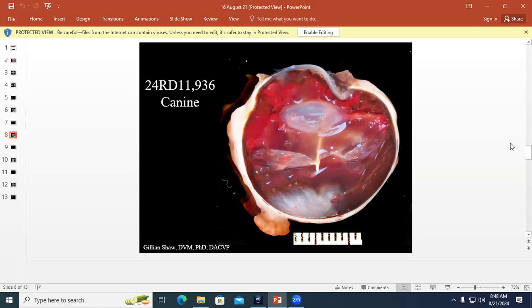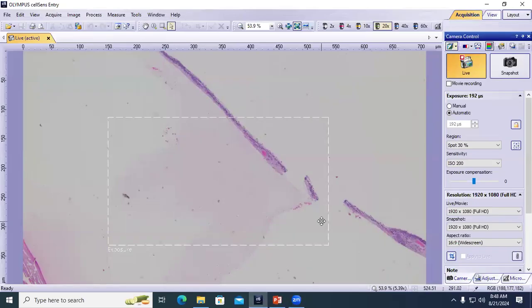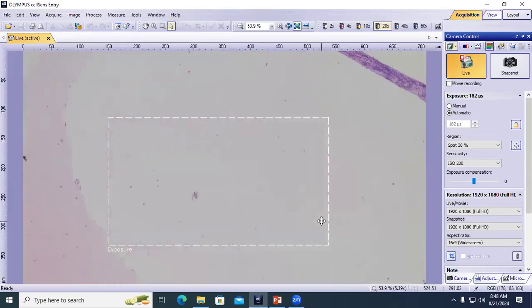The cactus quills are organized in a real specific way. They tend to be a little rounder, right? And then the cell walls are tubular, elongated. This is as much of a cross section as I have. That's some cool ones here.